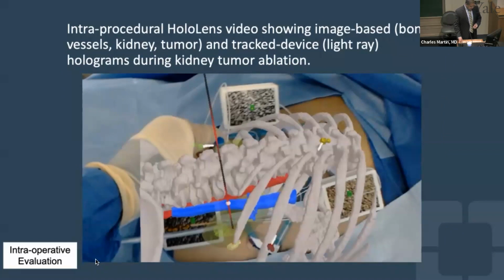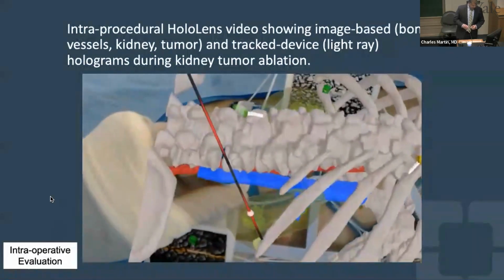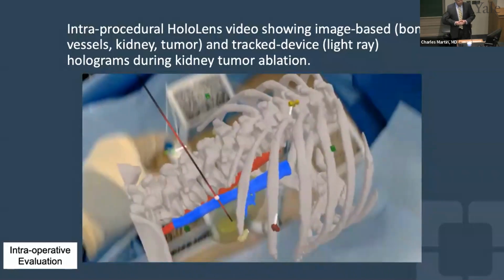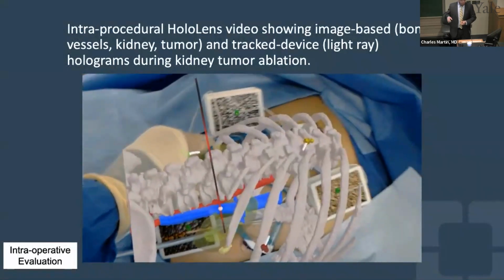And this is another one that shows some of our intraoperative evaluation. This was another tumor that was essentially exophytic right off the kidney that we were able to get to, navigating around ribs and such, and being able to get there without too much trauma. Fortunately, this patient had come to us because they had a complication, unfortunately, in an outside hospital where upon attempting a percutaneous access to this, one of the intercostal arteries was tagged, and this patient had come to me on call for an embolization. So we used this to model it before we were able to successfully embolize it, or ablate it, excuse me.